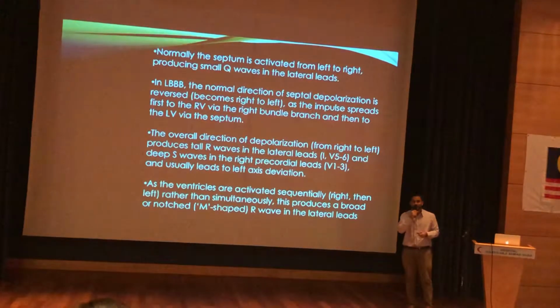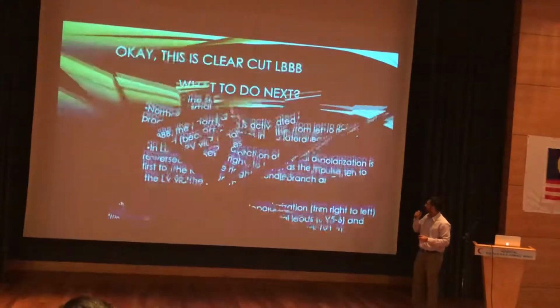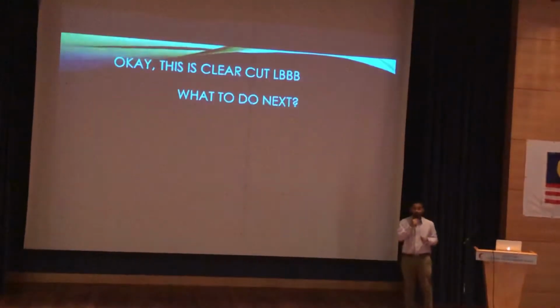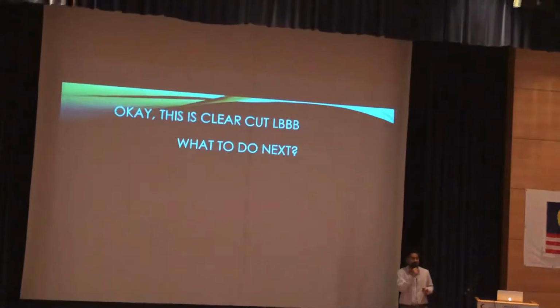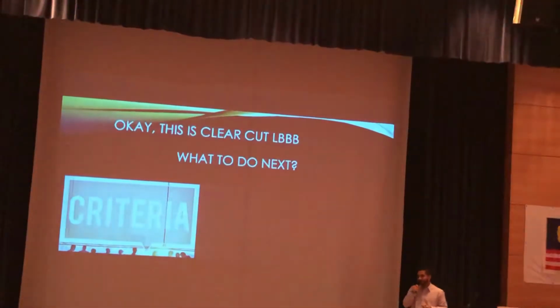So, ECG and LBBB. What do you do next? Patient gives a history of shortness of breath, maybe a bit of chest pain. You look for the criteria.